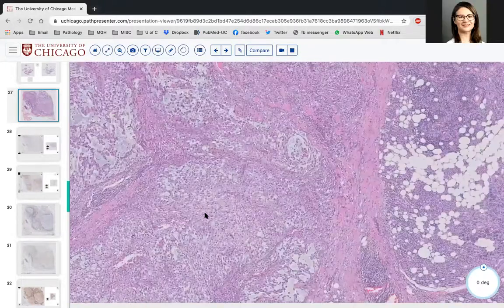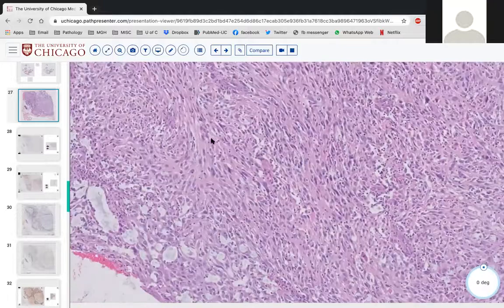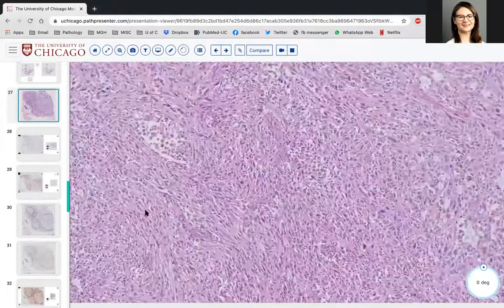Yeah, would myoepithelial carcinoma fit in this case? I believe so. Yeah. Oh, sorry. I thought you said, yeah, I did not say that. Rehab should get the credit. She's the one who said that before.